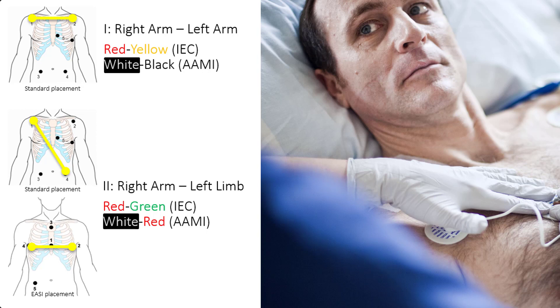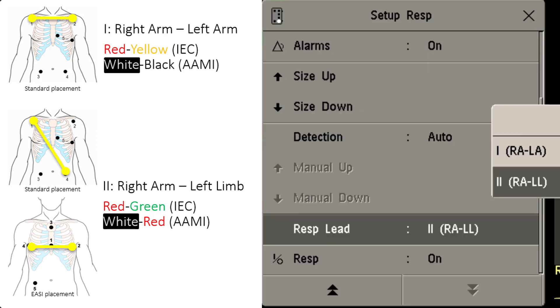Use the ECG electrodes to monitor the respiration rate. The measurement is done either between the right arm and left arm, or between the right arm and left limb location. Verify in the respiration setup menu from your monitor which lead is used.